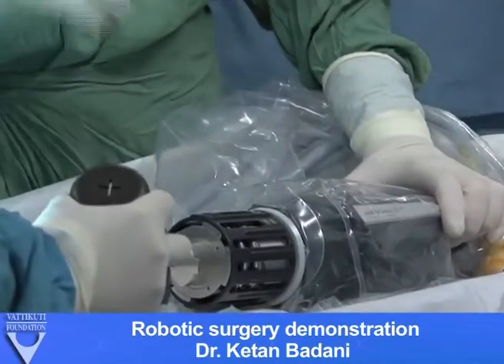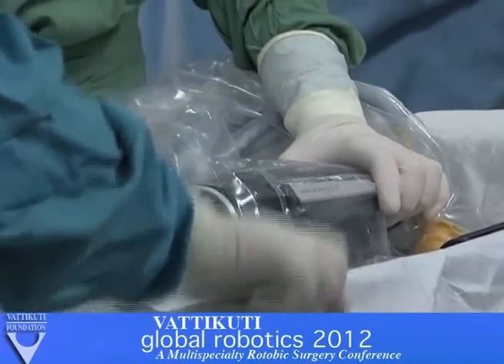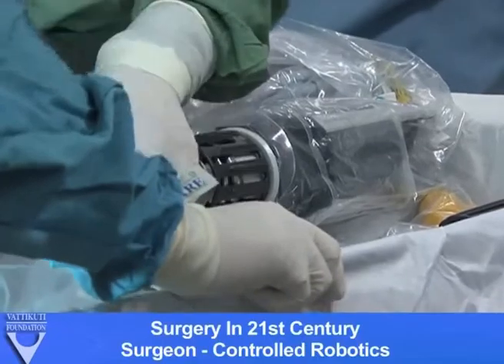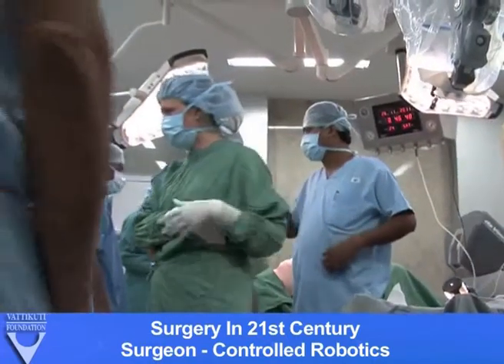Now, it's up to you. Some people will turn the light source off so it doesn't burn. But what did I tell you? The heat in the light source heats up the camera so that we don't fog inside the body. So sometimes what I'll do is I'll just keep this on — you'll put it in first. Does that make sense? Everybody's okay with that? You're okay with the draping and you're okay with that?